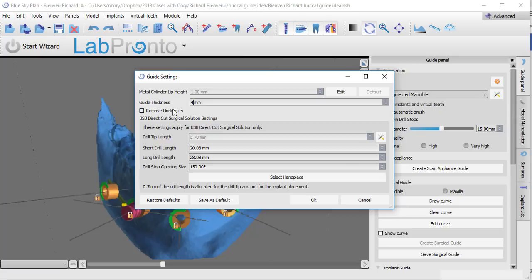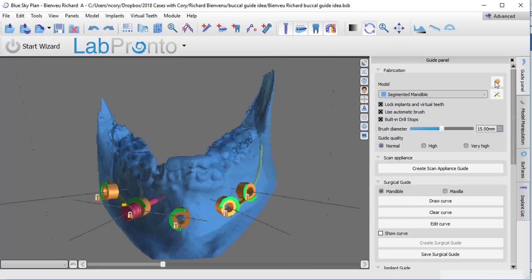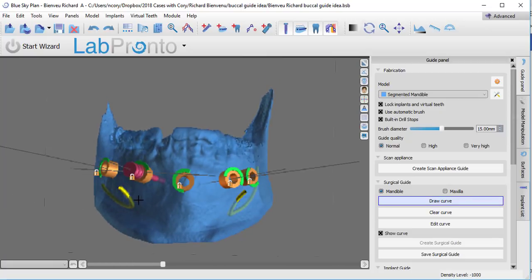The other thing that we're going to do is that normally the software defaults to removing the undercuts, because it's got to have a path of draw. We don't want to do that here. We want to maintain all the undercuts because that's exactly how this guide is going to index straight on the bone. It's going to index into the bony undercuts. It's got to intimately fit against that jawbone. So we're going to say not to remove the undercuts, and everything else should be okay here. Now I'm going to go about drawing the guide. We come down here and hit Draw Curve. I tend to make this very over contoured from what it needs to be.